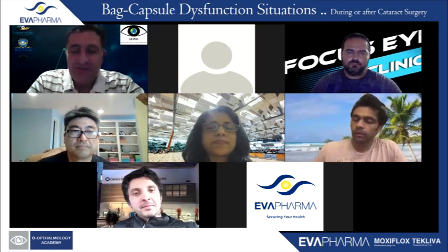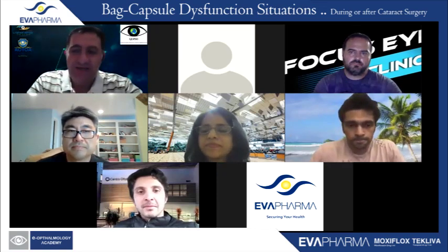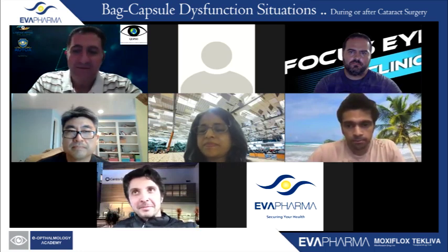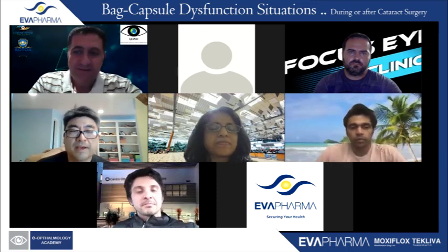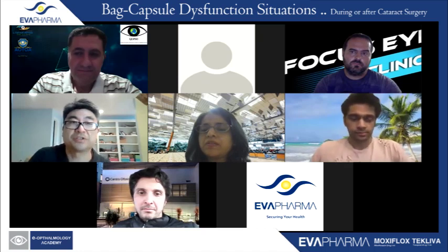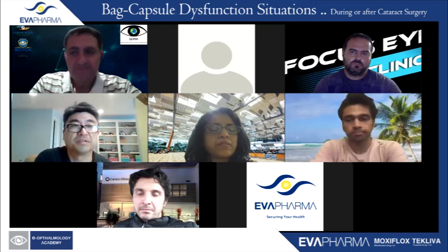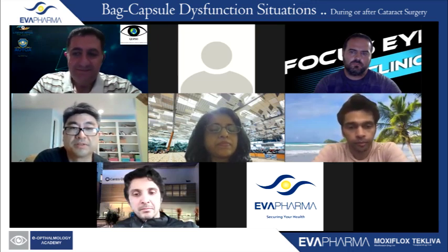Just a question, you need a good assistant to screw the IOL, because I think you cannot screw the IOL and bring the haptic from 6 o'clock. You need a good assistant to screw this type of IOL. Yes. Yeah, I mean, once you externalize a leading haptic sufficiently, you could actually go ahead and take over with injecting the remainder of the lens. So yeah, but that very beginning part is important. Yes.